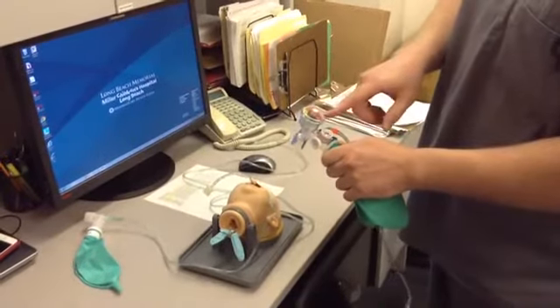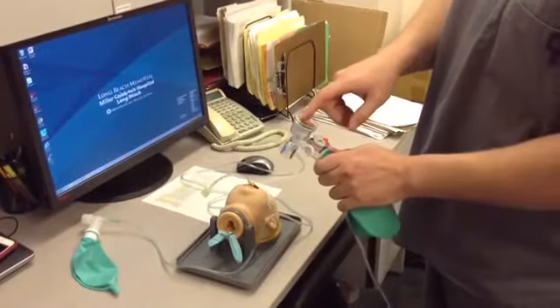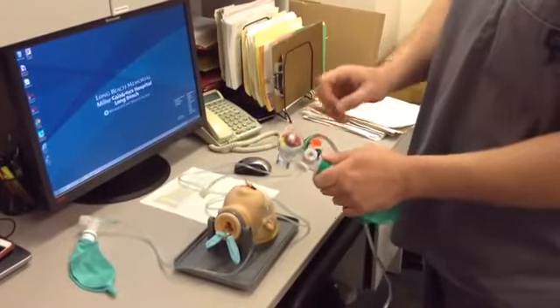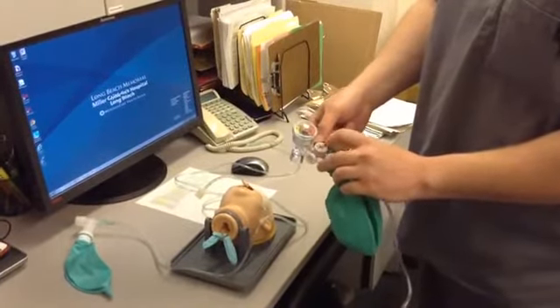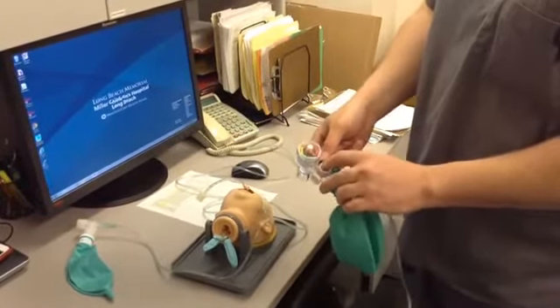So the pressure gauge is color-coded, green for a good working pressure, yellow for potentially dangerous, and red above 40, which is your danger zone. The next feature on here is your pop-off valve. If you can see the lettering on the pop-off valve, you're active. So it says 40 centimeters of water pressure, pop-off active.